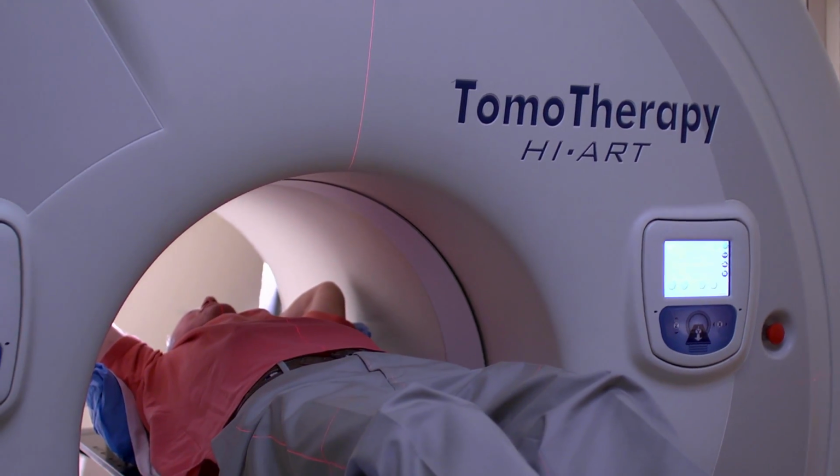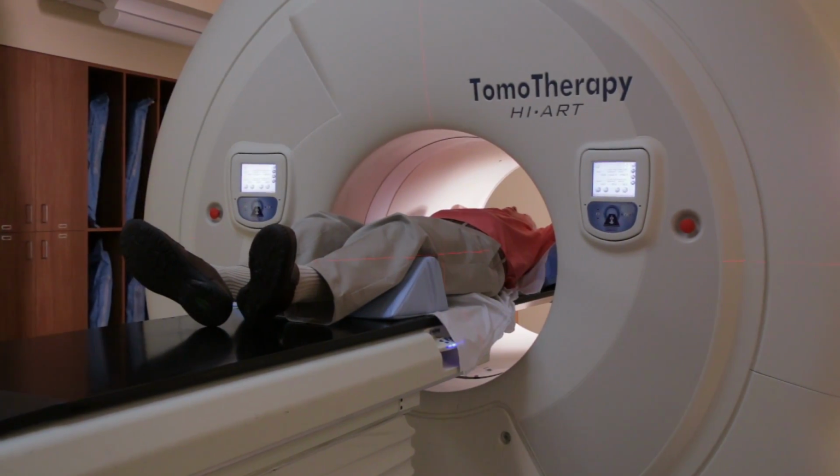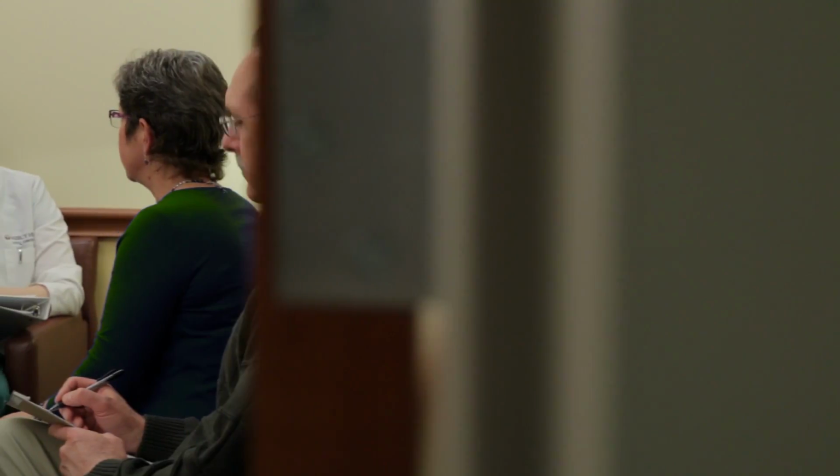Most of our patients come for 6 to 8 weeks of the radiation therapy on a daily basis. The treatments vary in length based on what treatment machine you're on, but they're often anywhere from 3 minutes to 7 minutes. Radiation therapy is a very powerful therapy, and you can develop side effects, so it's very, very important for the radiation oncologist to monitor your side effects at least once a week. And certainly if things change in between visits, we always encourage patients to mention it to the nurse or doctor so we can see you in between treatments.